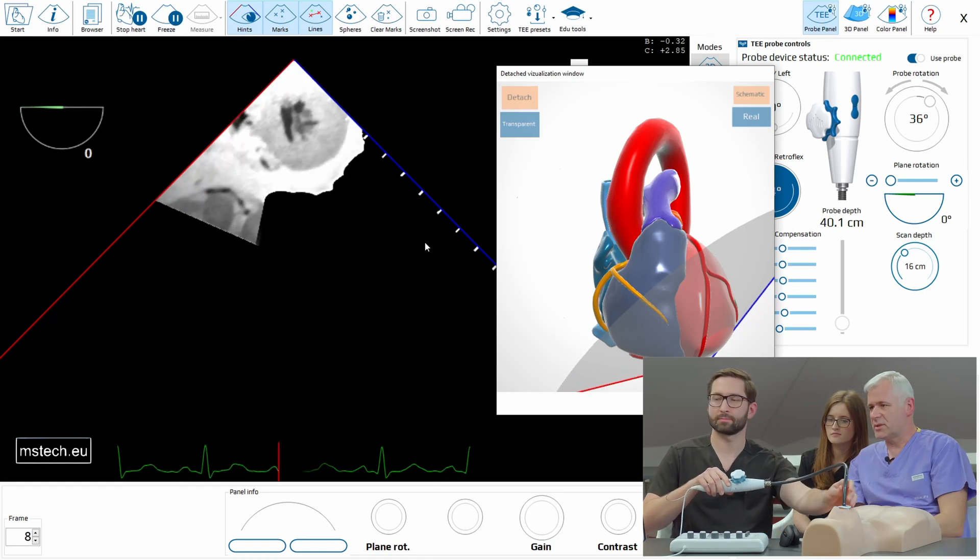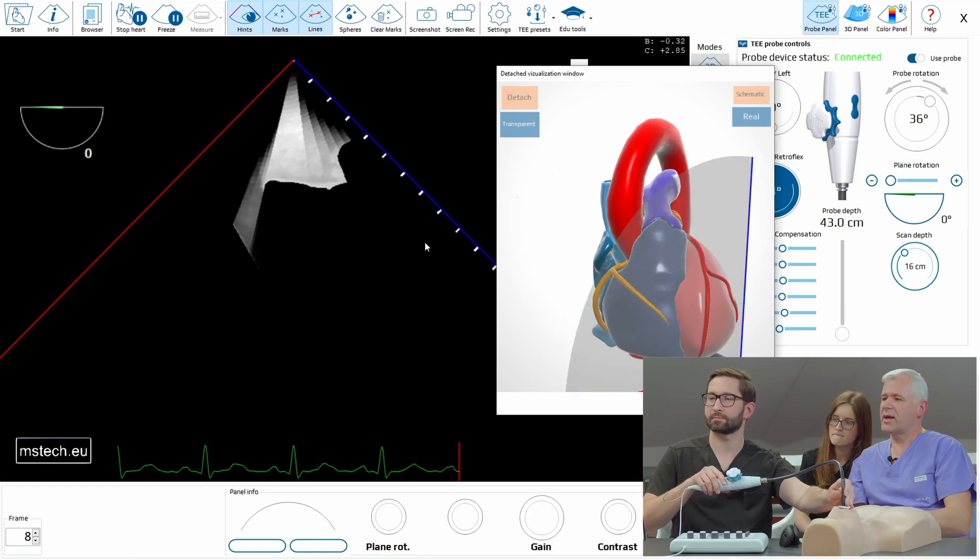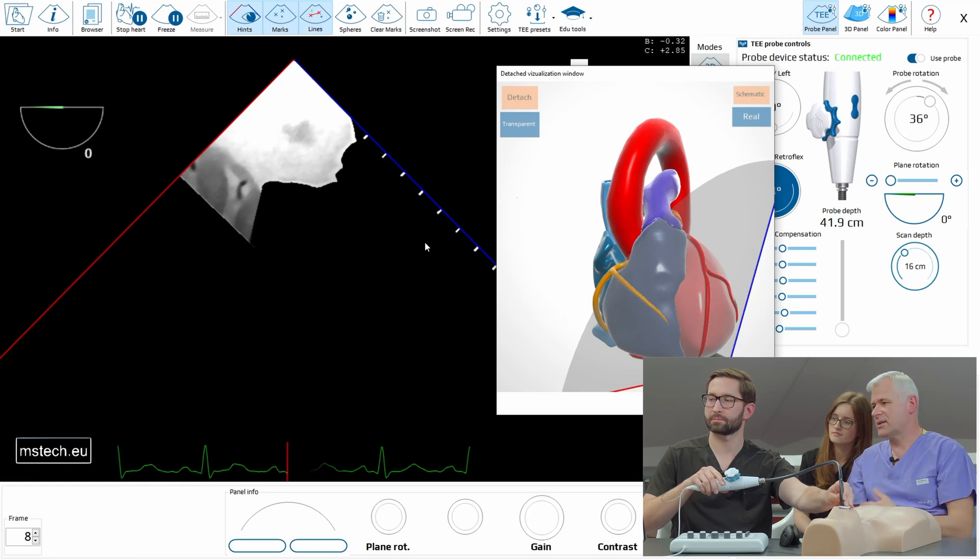So you go deeper, much deeper. And now you have to do really huge antiflexion.